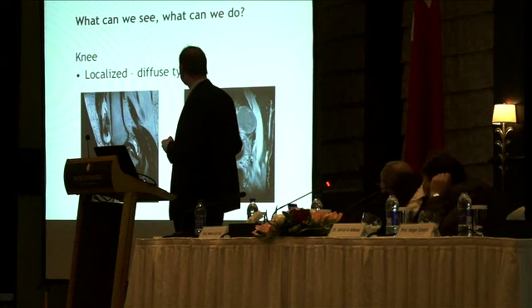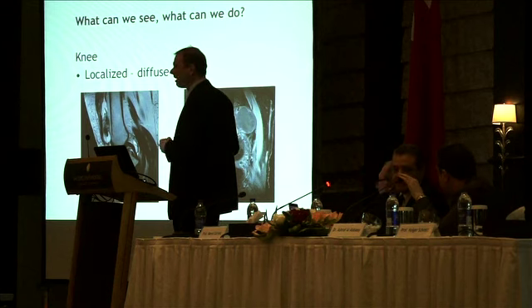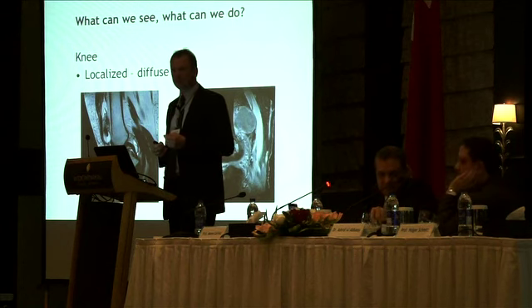But if you have such a situation as you can see here, the same lateral view, this is the femur, this is the tibia, you see here the patella, the quadriceps tendon, the patellar tendon, and you see synovial tissue everywhere. And even here, you see a very thick formation. So is it possible to do by an arthroscopy?